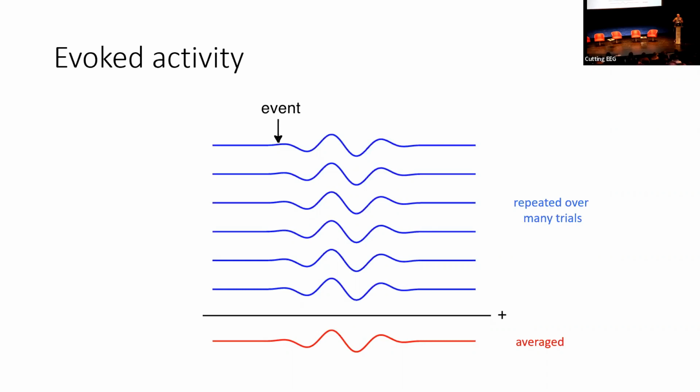But we usually try to get as many trials as we can, which for some participant groups, like infants, is not a lot. If we're recording EEG from babies, we're happy if we have 5 minutes of data, and that still takes about 3 hours to set up the whole experiment. So then we know that we need a lot more participants than if we're doing the same type of experiment with adults, where we can easily get an hour of data from each participant.